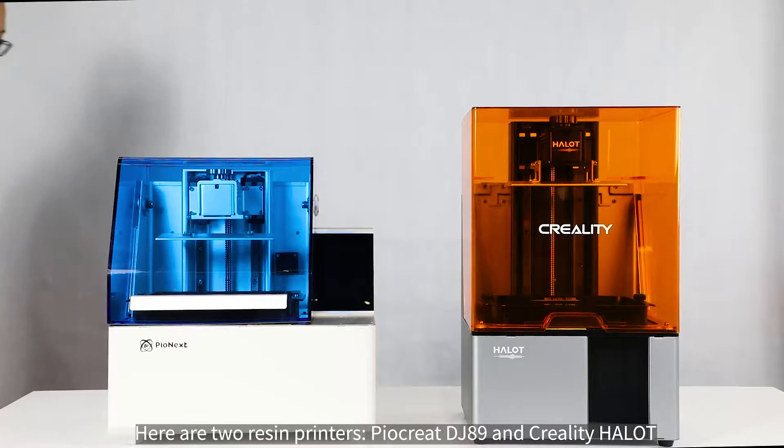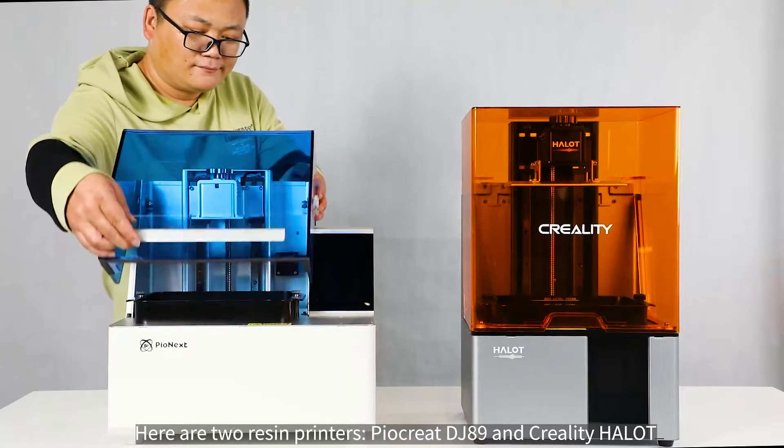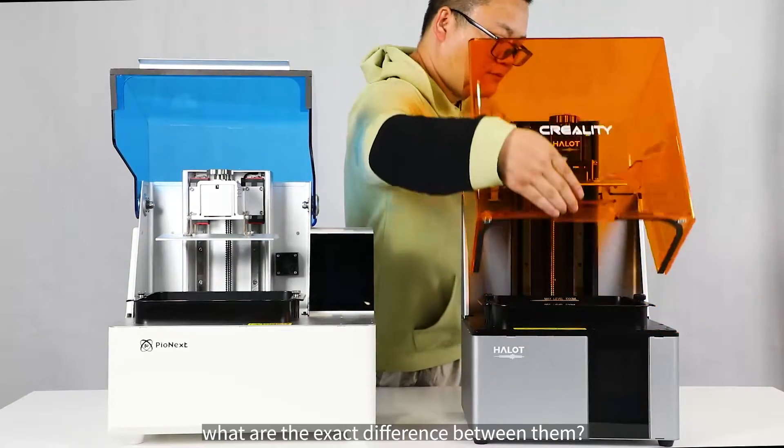Here are two resin printers: the Piocreat DJ-89 and the Creality HALOT. What are the exact differences between them?